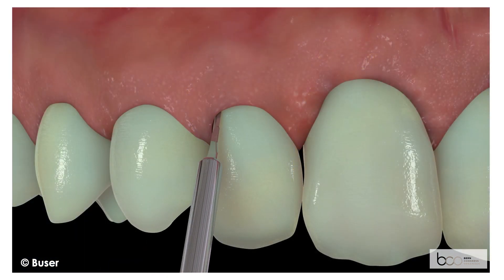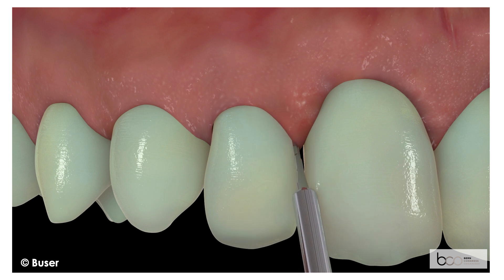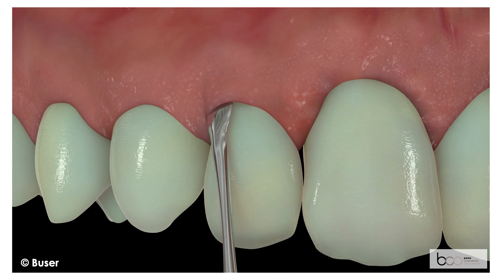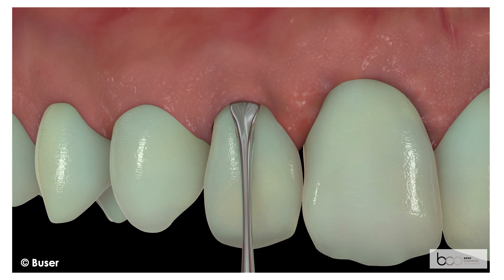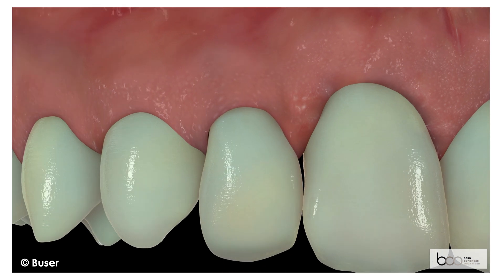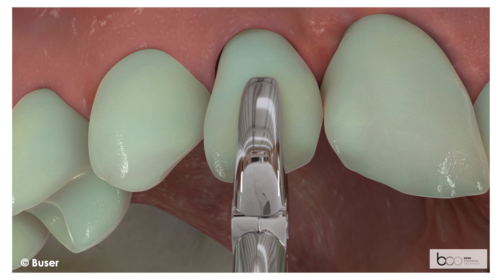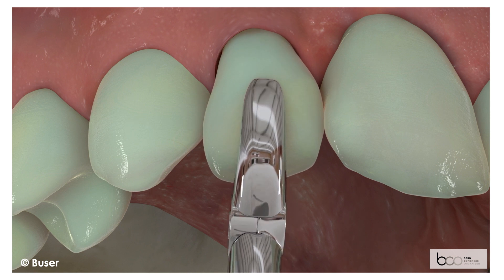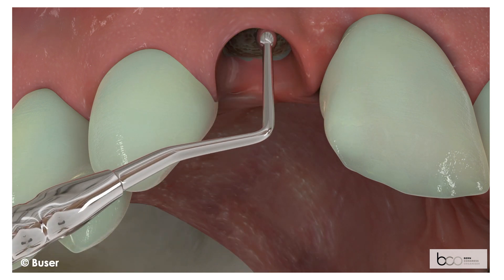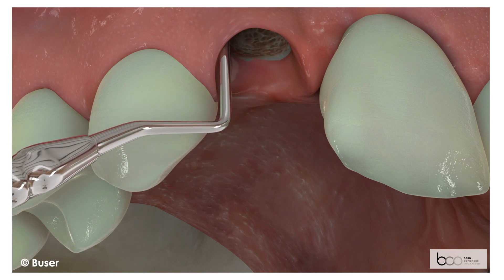The extraction is initiated with an intrasulcular incision using a micro blade. The gingival margin is carefully mobilised with a fine periosteal elevator. The extraction is carefully done with a rotational movement. The socket is then debrided to remove the granulation tissue.